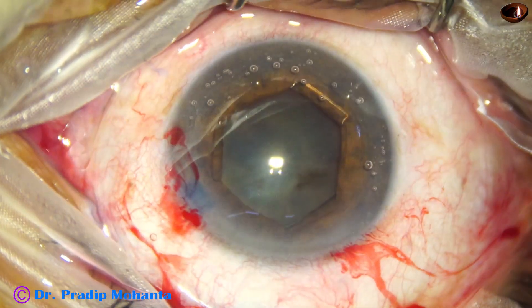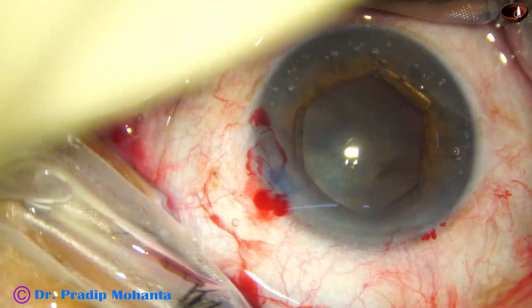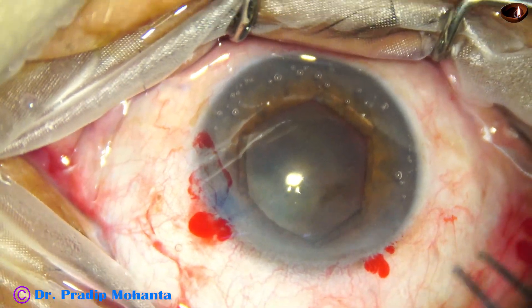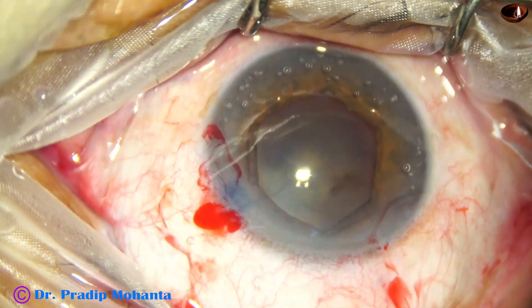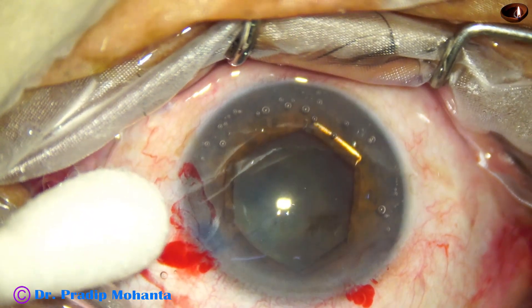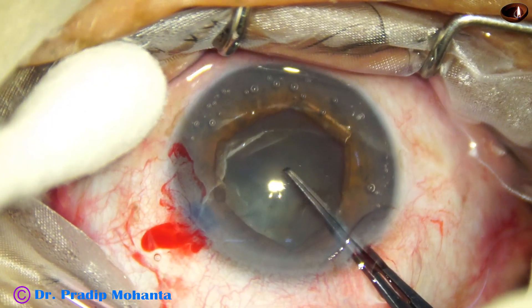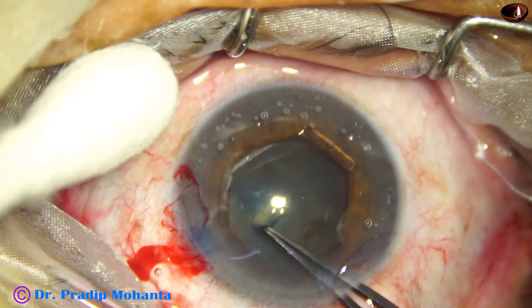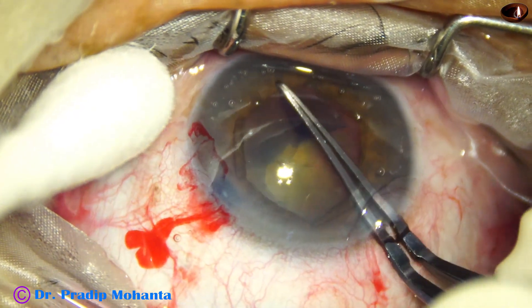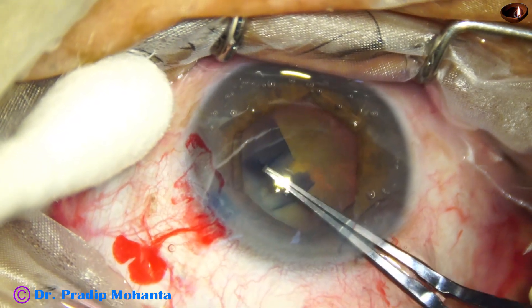The pupil takes a beautiful hexagonal shape. Visco again, and now the time for capsulorhexis. Using utrata forceps to do capsulorhexis — the tip of the forceps pierces the center of the capsule, a capsular tag is raised, and this capsular tag is guided all around.